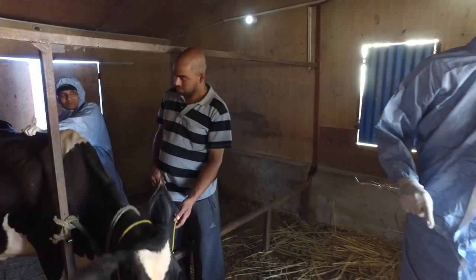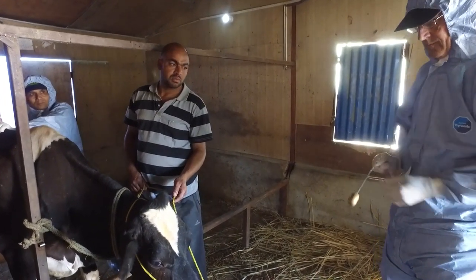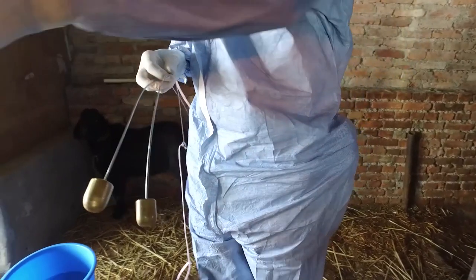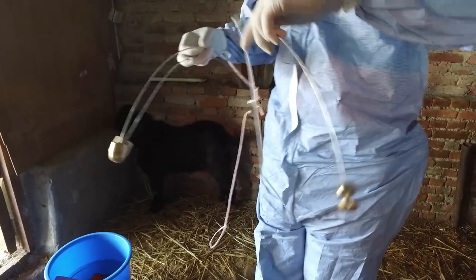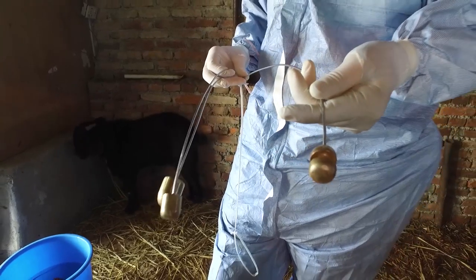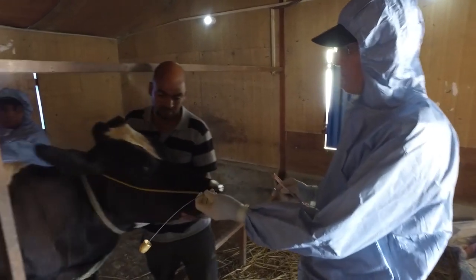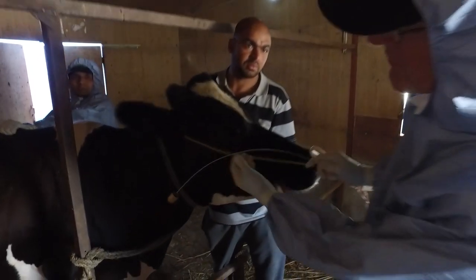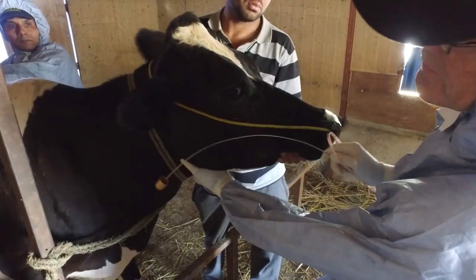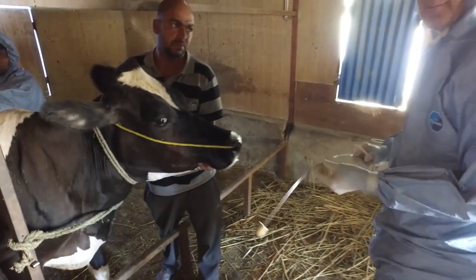You should start by making sure that the animal is safely restrained and that somebody stands at the side of the head to hold it for you. A range of different sized probangs are available and you should select the appropriate one for the animal you wish to sample. You are aiming to introduce the probang cup to the upper oesophagus, which is just above and beyond the larynx. You can easily feel the larynx from the outside on the animal's neck. Hold the probang rod up to the side of the head to see how far it will need to be inserted.